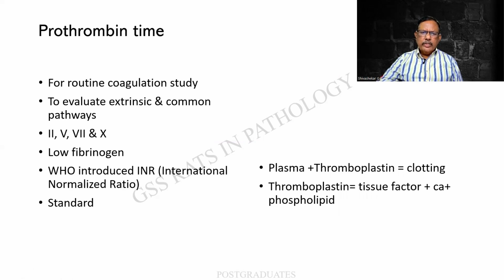The WHO introduced a term called INR, which is International Normalized Ratio. This is likely to vary from place to place depending upon the thromboplastin that is being used. However, this is a standard that should be followed. And when thromboplastin is added to the plasma, it leads to clotting. And what is the thromboplastin? It is nothing but tissue factor plus calcium plus phospholipid. That is what I had shown you in one of the first slides.